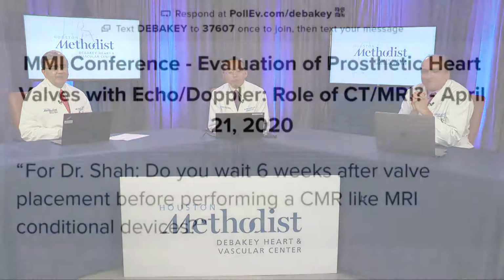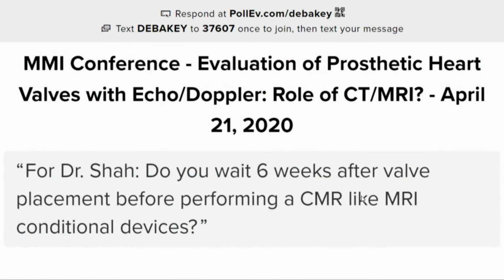A question to you, Dr. Shah. Do you wait 6 weeks after valve placement before performing a CMR, like MRI conditional devices, etc.? Yes, that's a very good question. The reality is that the reason we recommend waiting 6 weeks for a pacemaker or defibrillator device is actually not so much because you're concerned about migration or lead dislodgement in the first few weeks. That's a very small risk. The reason we wait is because we want to make sure that the pacing and defibrillation thresholds are stable.